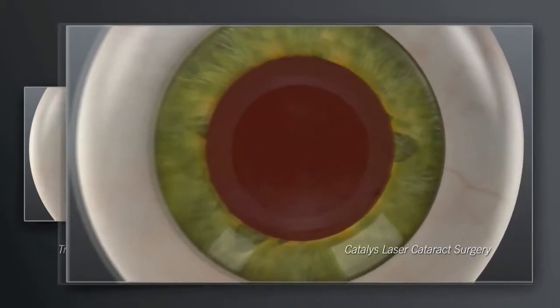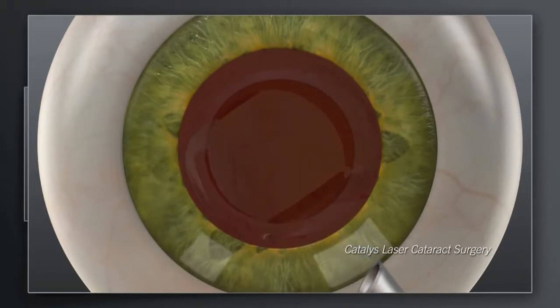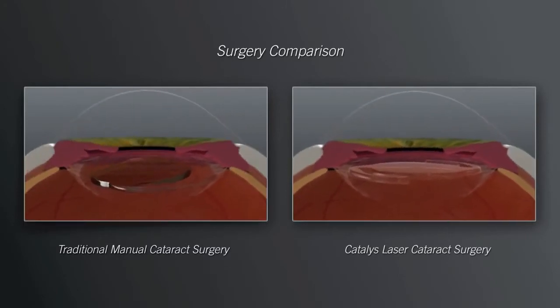This gentle, low-energy approach may make your visual recovery more rapid. For both traditional and Catalyst procedures, the precision of these steps sets the stage for accurate positioning of the replacement lens. And accurate positioning of the replacement lens is critical for achieving the desired visual outcome.